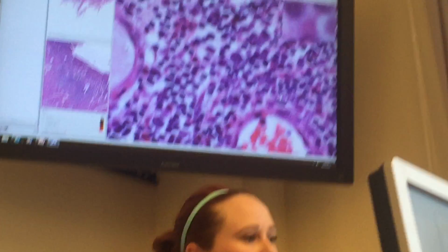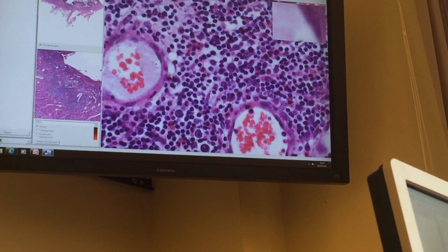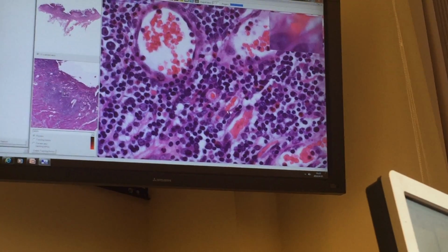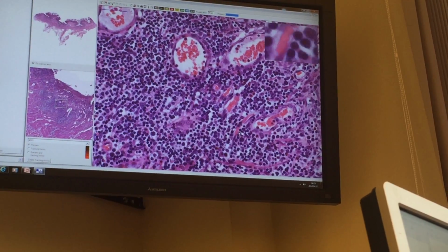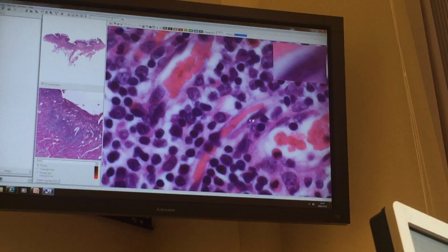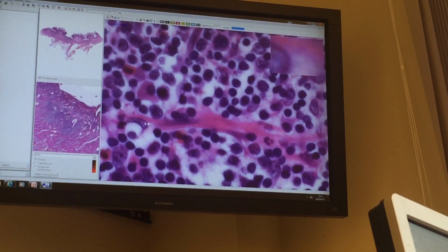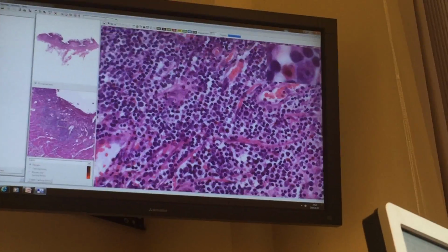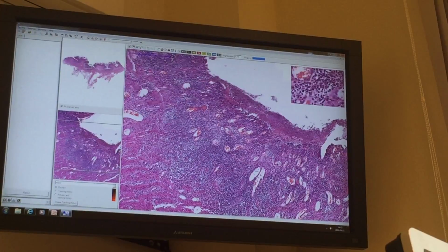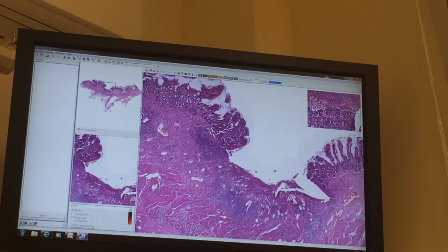It's not too close. No, it's not that stage. It's more common to see fibrin. The capillaries are very tiny, and on these lines on the inner surface, can you see this line? This is an endothelial cell. Even this one, this is endothelial. In the next stage, it will do fibrosis. In the end, when it's healing, the fibrosis will be dominant, yes.